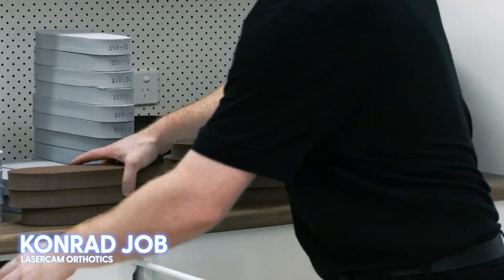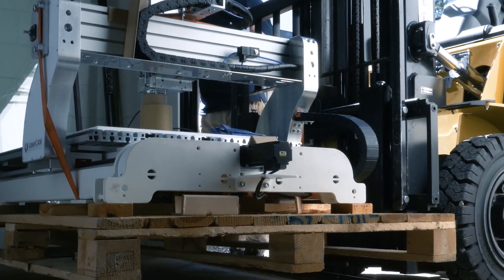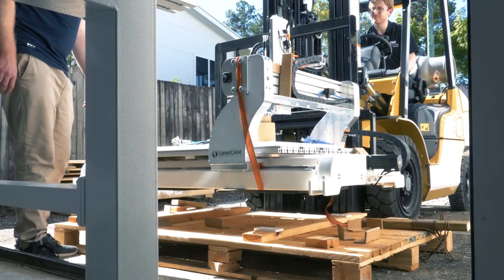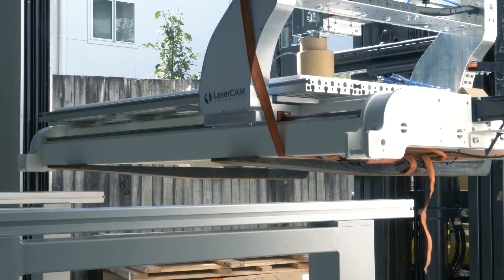I'm Conrad and I work for Laser Cam Orthotics. We're distributed by Podcam Suppliers in Australia, but we distribute computer-aided design software, CNC routers, and 3D scanners to customers all around the world. We're here today setting up one of our six-pair production systems for foot orthotic manufacture.